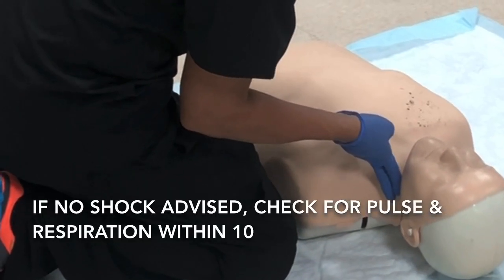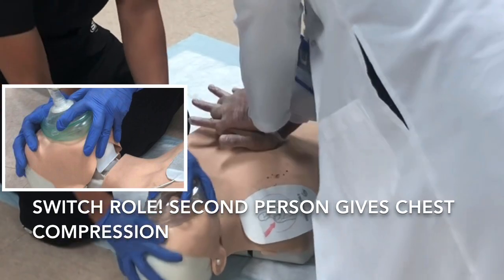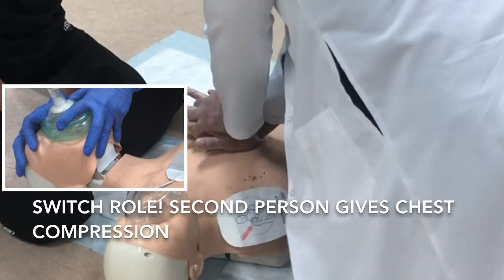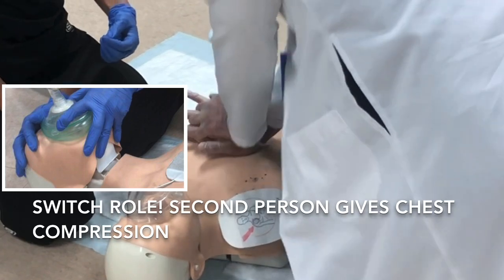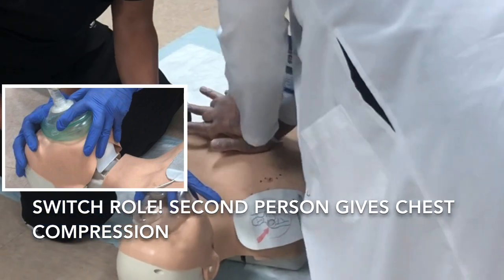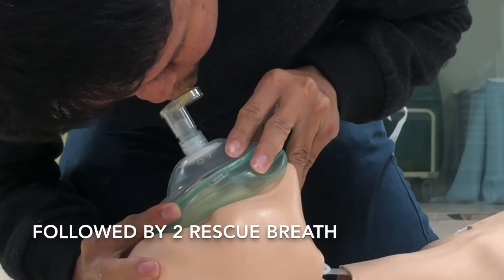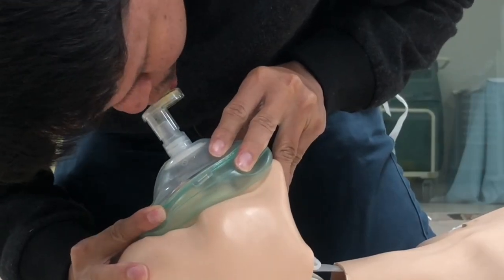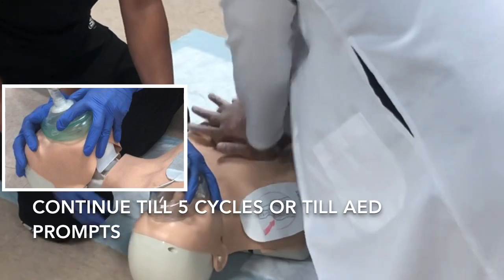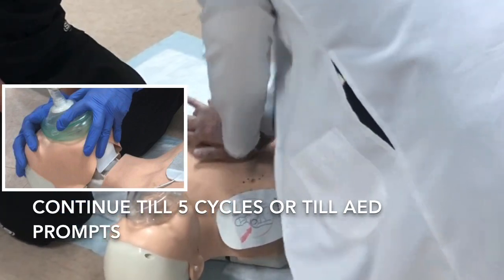No pulse, no respiration. We need to hear the click — ensure proper mask seal for effective ventilation.